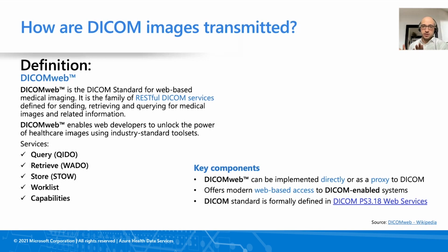For example, in a hospital, there was a CT scanner, and once a CT scan got done for a patient, the image was pushed into the picture archival and communication system, the PACS system, so that in PACS the radiologist can view the image and write the report. And then once that image gets out of the clinical workflow cycle, it was pushed into the VNA in the given hospital, which is the vendor neutral archive system, which keeps the image for longer archival purposes. But recently, with DICOM Web, there is a big push from PACS and VNAs to cloud-based picture archival solutions for DICOM.